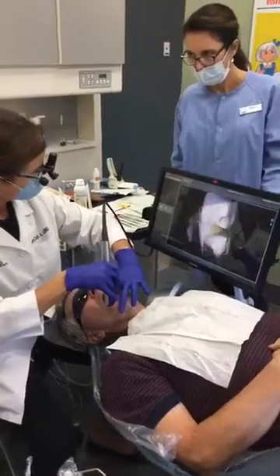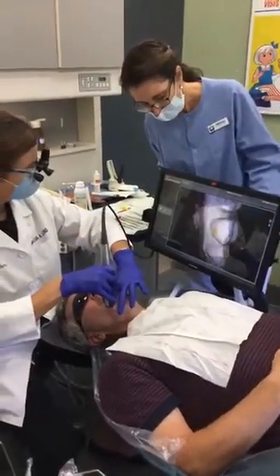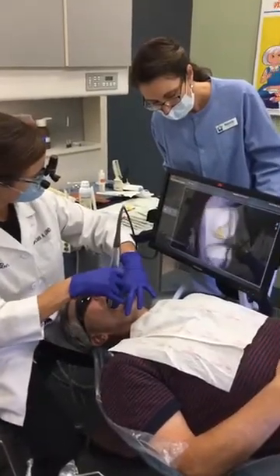So those are in fact Stephen's teeth — there are Stephen's teeth. This is going to be custom made just for him and we won't get anyone else's teeth.